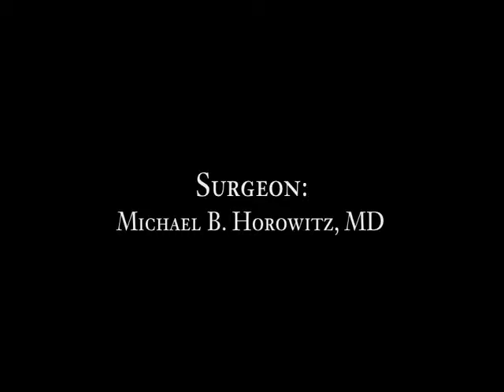Endovascular coiling of ruptured 3.5 millimeter anterior communicating artery aneurysm, February 2012. The surgeon and the narrator, Dr. Michael Horowitz.